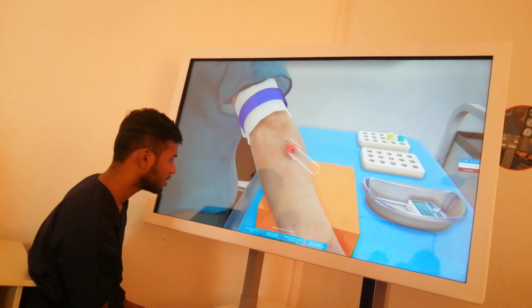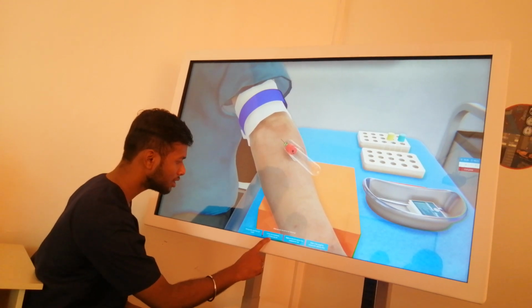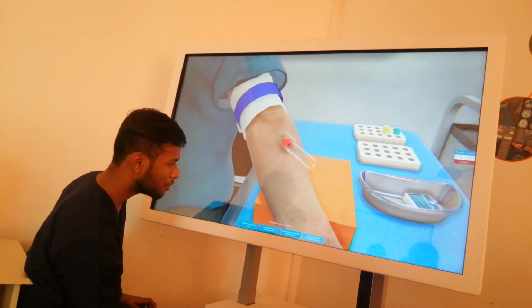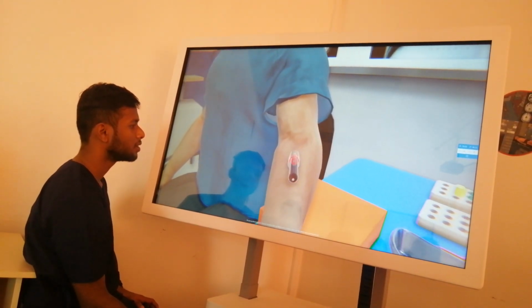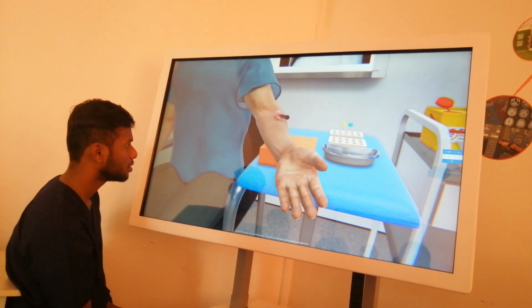What process should be the following? Remove the tube from the holder. Loosen the tourniquet, unclench your fist. Apply an alcohol wipe to the vein puncture site. Make a few wiggling movements with the tube. As soon as blood begins to flow into the tube, loosen or remove the tourniquet. Make sure the patient has unclenched his fist.